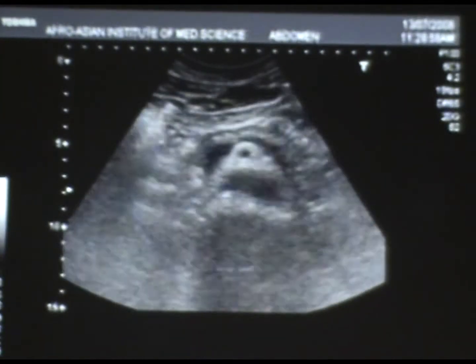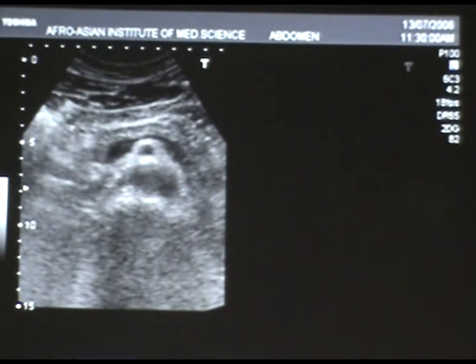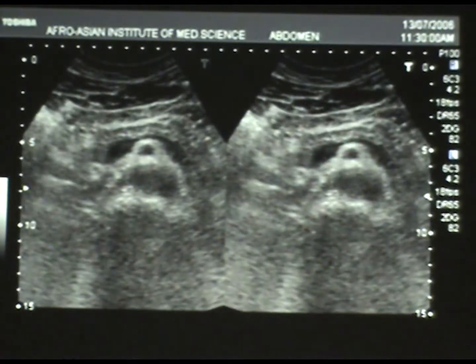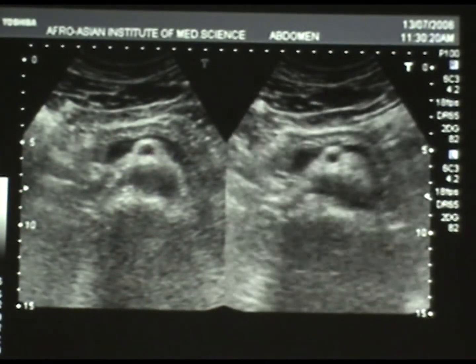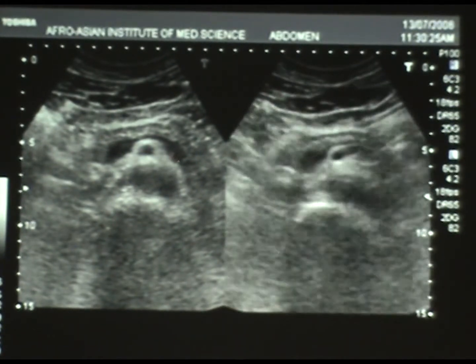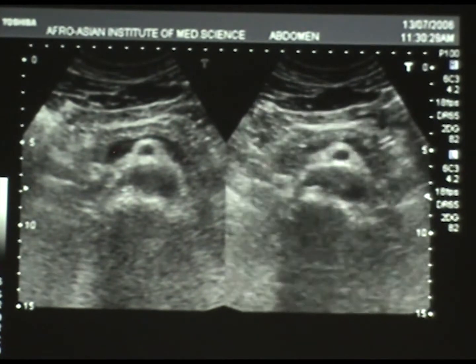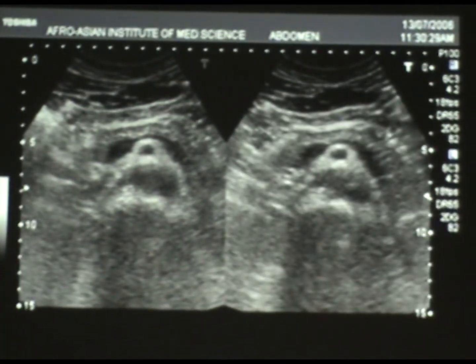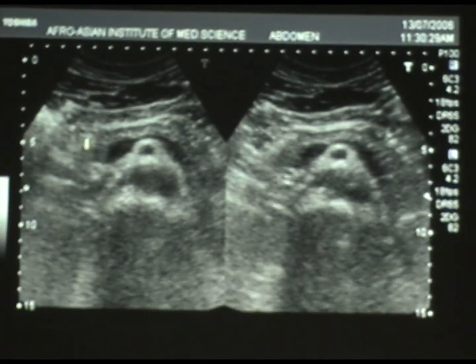These are the pancreas in the epigastrium, whereas you can see this hyperechoic wall, and this vessel is the superior mesenteric artery, and then we have splenic and portal veins. This is called the portosplenic confluence, and then we will have aorta and IVC here at the base. You can see them separately.